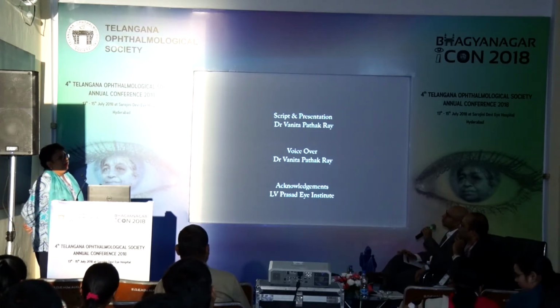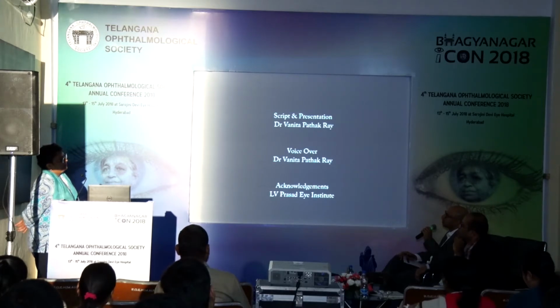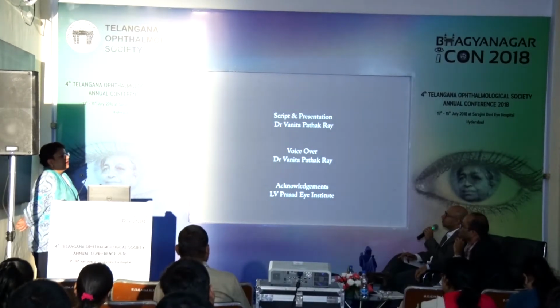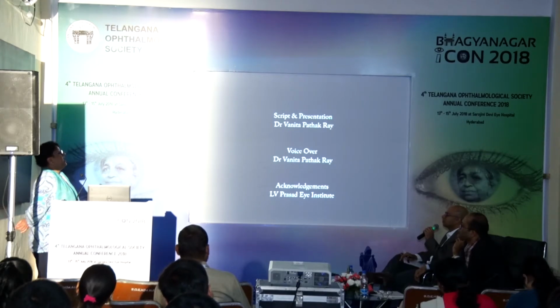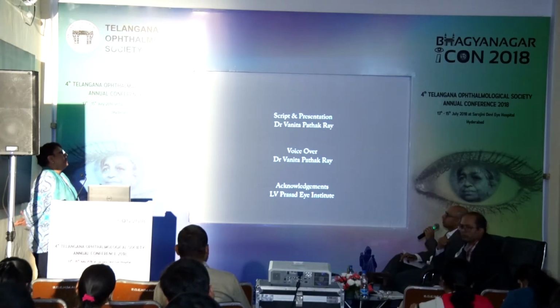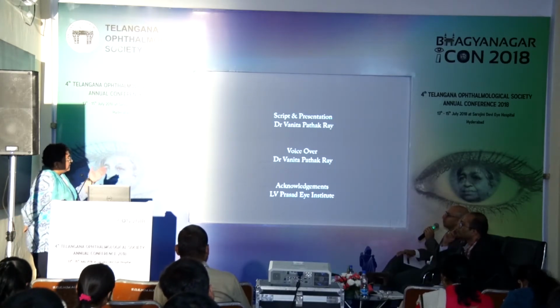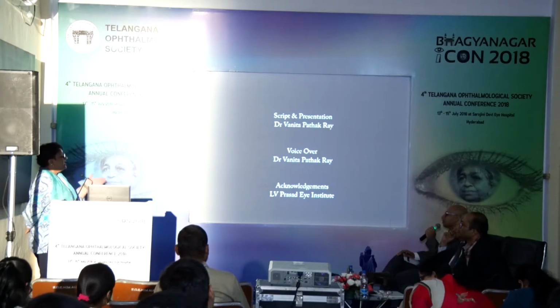Because you can't really be sure it's going to be a plateau iris. No, you can be sure prior to surgery. But yes, it is actually a procedure that can be utilized with cataract surgery in all cases. It spares the conjunctiva, so if you need a trab later on, you can still do it. In open angles you would try this? Open angle, it is established anyway. Yes, it is established. It's angle closure.